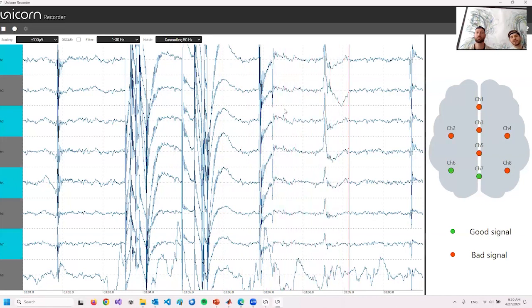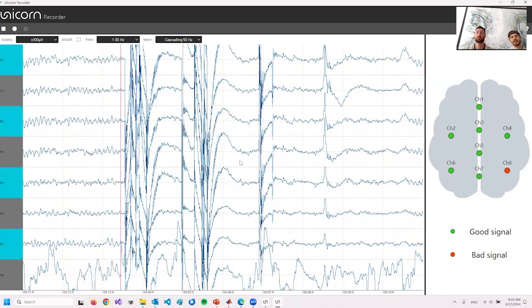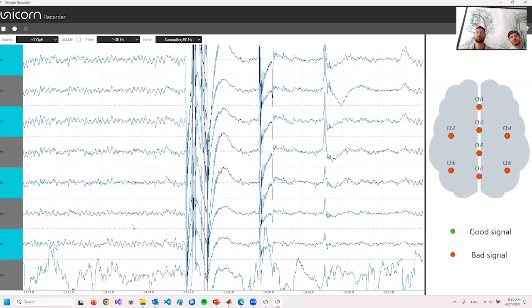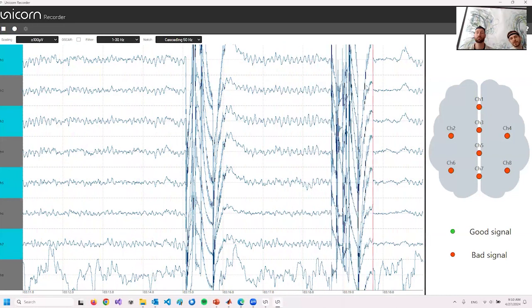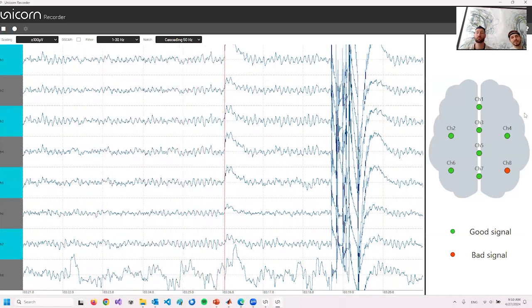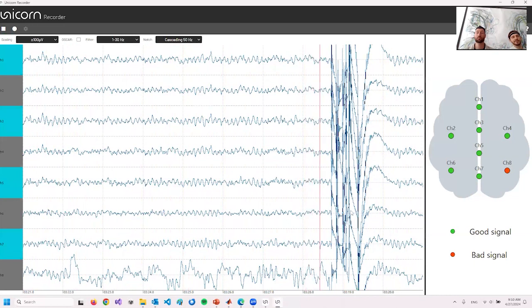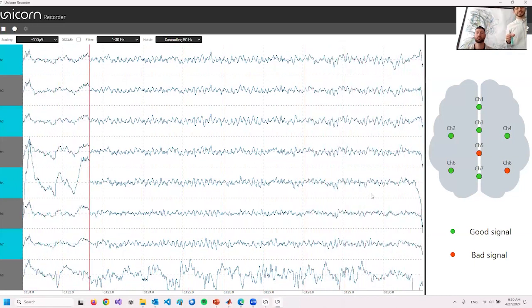And now you can close your eyes for about 10 seconds. And now we can see some low frequency and high amplitude signals with a frequency of about 10 hertz. And that's some real EEG data. These are alpha waves. So Leo is very relaxed. So we have to give him a task soon.